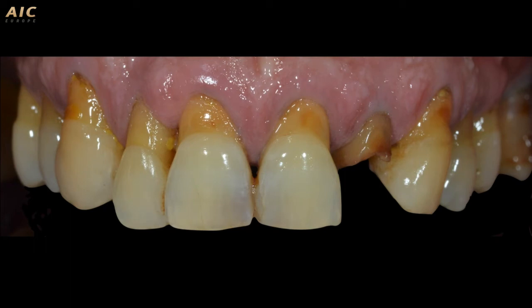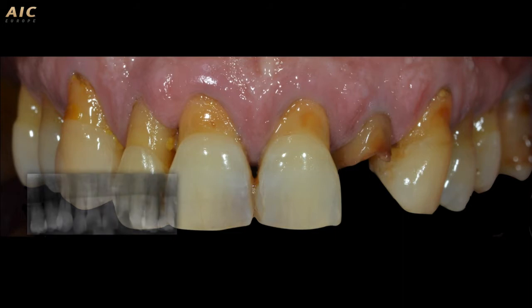This is the clinical case of this webinar. We have a fractured tooth in the 22 zone. We chose to extract this tooth, and in this way we can replace it for aesthetics and function with a dental implant.